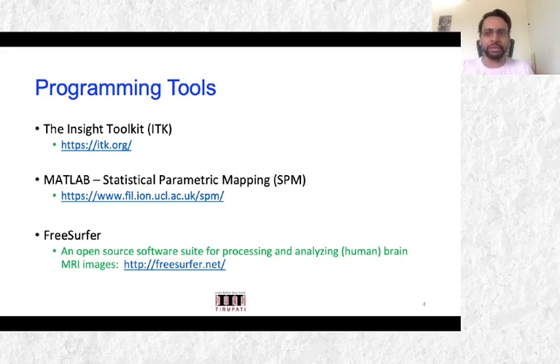and one of the popular ones is the Insight Segmentation and Registration Toolkit, which is commonly referred to as ITK. I would also give a brief introduction to ITK, and if I have to mention just a couple of other tools, I would say MATLAB's statistical parametric mapping tool, referred to as the SPM tool, and the FreeSurfer tool. This is what I would briefly touch upon in this presentation.